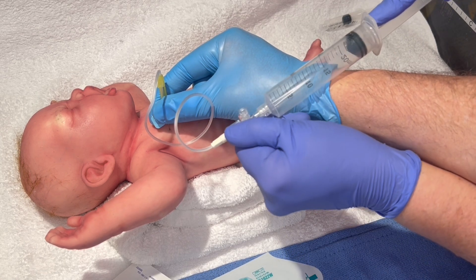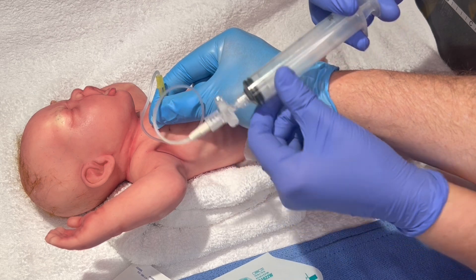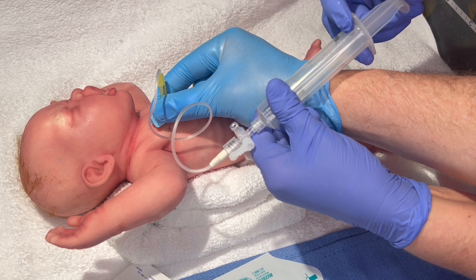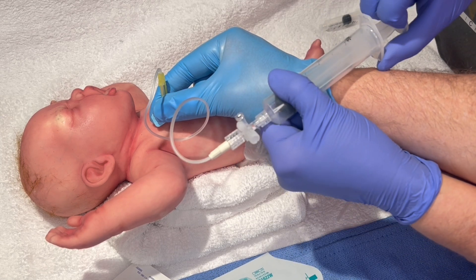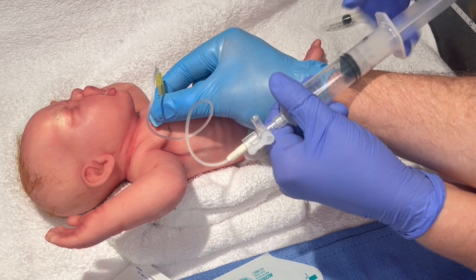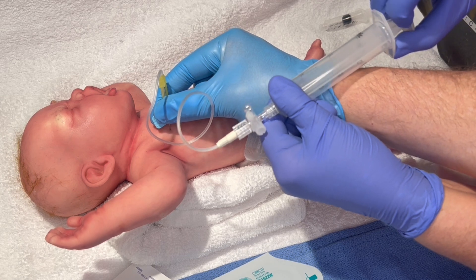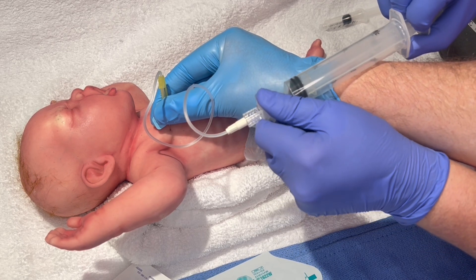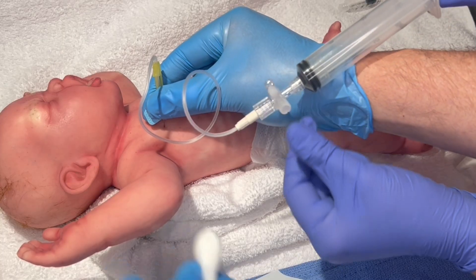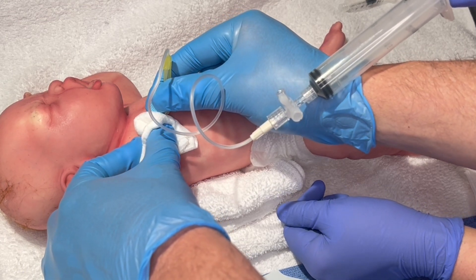Make sure that your stopcock is off to the atmosphere as you withdraw air from the chest. You then turn off to the patient and push the air out to the atmosphere. Turn back off to the atmosphere. Withdraw again if there's still air in the chest, holding the needle very steady. You then go off to the patient, back out to the atmosphere, and repeat as needed. Once you have withdrawn all the air from the patient's chest and you're sure there is no more to accumulate, stop withdrawing air, place the gauze over the needle, and remove.